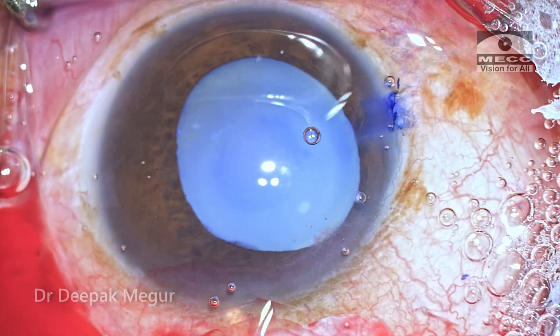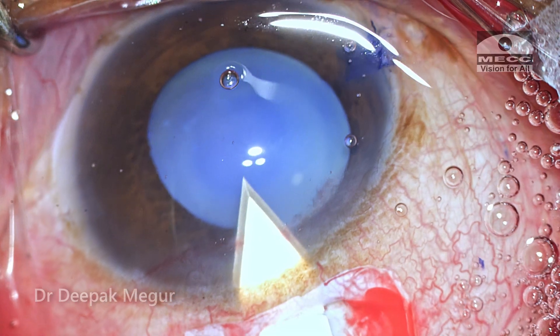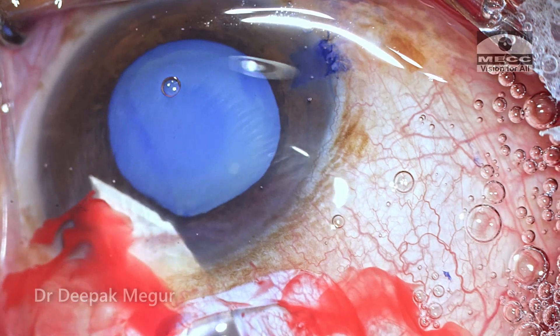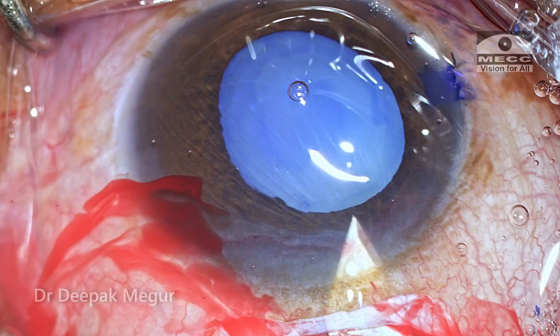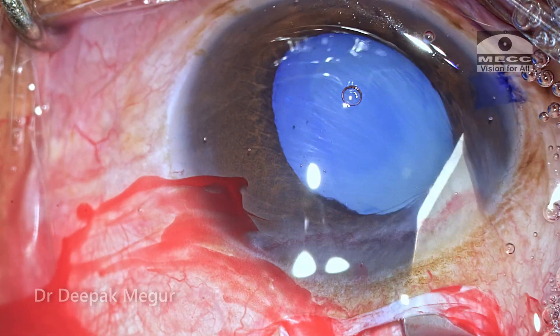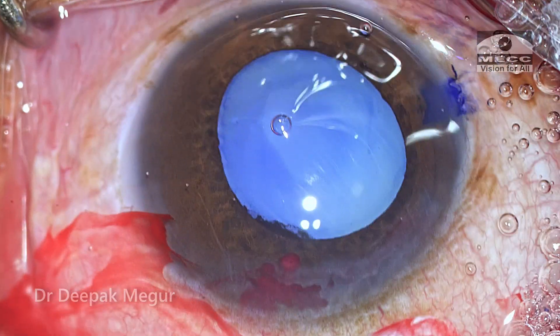After filling the chamber with dispersive OVD, the anterior chamber is entered using a sharp keratome and I've extended the entire width of the tunnel. The internal lip always runs parallel to the limbus, at least one millimeter away from the limbus. This ensures the self-sealing nature of this wound.